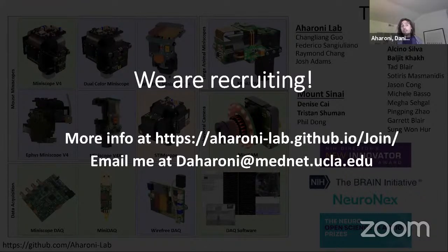In terms of wire-free stability and a wireless Miniscope, the mounting of the Miniscope onto the skull of the animal for our newer microscopes is a rigid connection of aluminum on aluminum. The bottom of the Miniscope has an aluminum sleeve and the base plate is aluminum. These newer generation Miniscopes have a set screw that locks the Miniscope into the base plate. That set screw is a conical point set screw. When you tighten it, the conical point locks into an indent in the bottom of the Miniscope and basically rigidly registers the Miniscope in X, Y, and Z into the base plate.